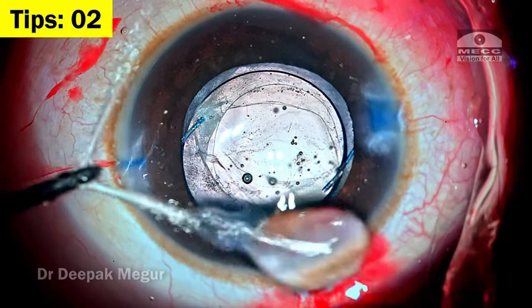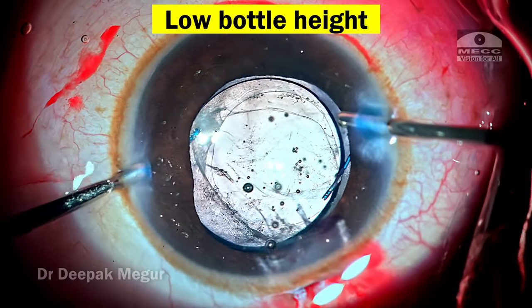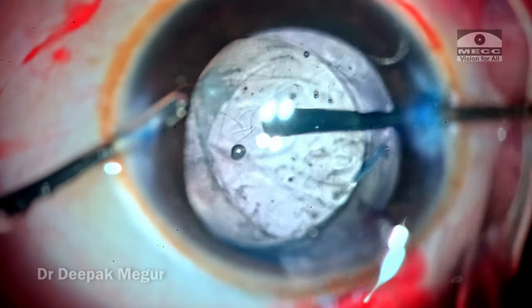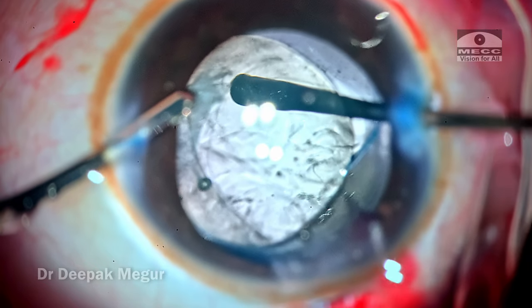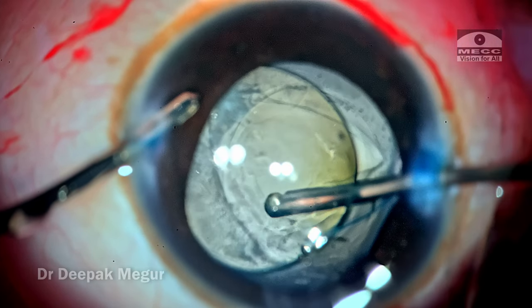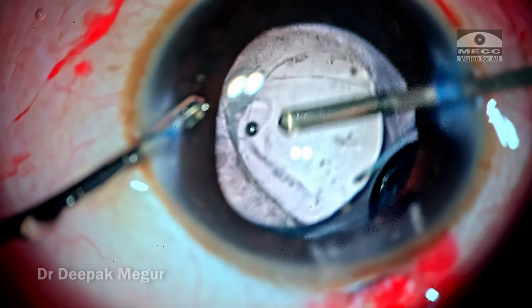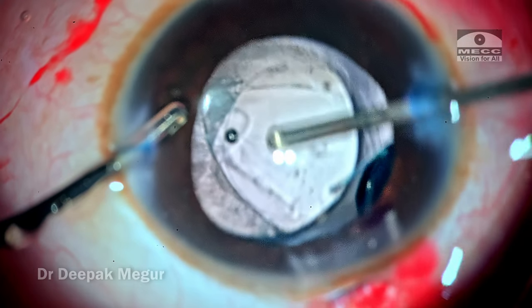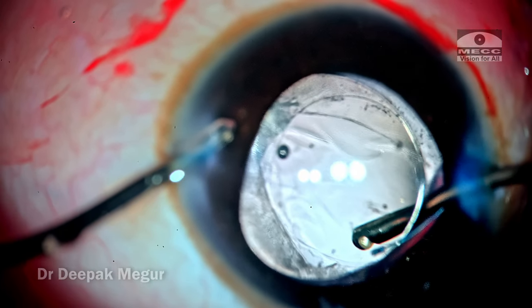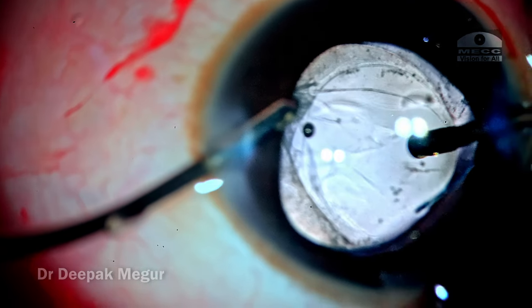Time to remove the OVD which is behind the IOL in the vitreous cavity. Very important tip: when introducing the irrigation cannula with the left hand, bring the bottle height down to its minimum. In children with very low scleral rigidity and in post-vitrectomy eyes, the moment we introduce infusion the eye is going to stretch, and there is a chance the lens can be pushed back and drop into the vitreous cavity. Negotiate the irrigation line into the eye gently, start irrigation gently, and only gradually increase bottle height once the vitrector is behind the lens. Avoid sudden high infusion pressure with the posterior capsule open.